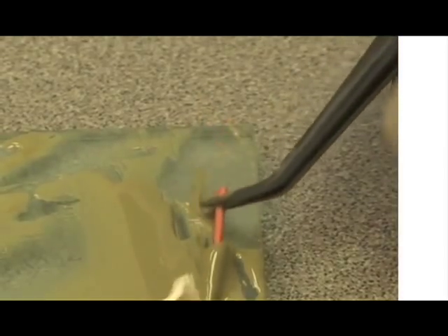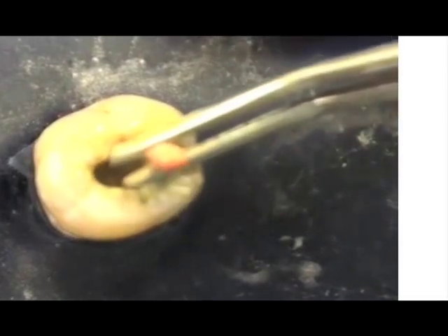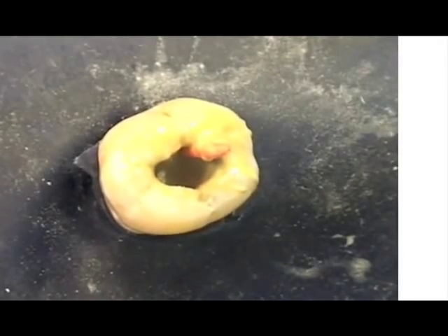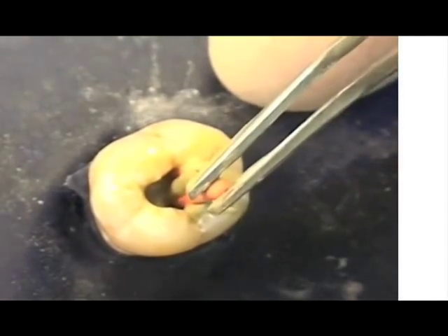Each point is then liberally coated with cement and introduced into the canal. You know you have applied enough cement if excess escapes from the canal when you place the well-coated master point. Here you see me placing all three points at one time.